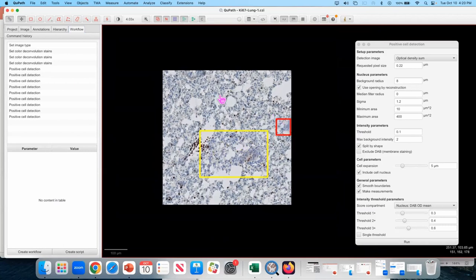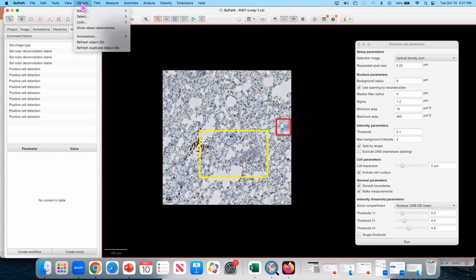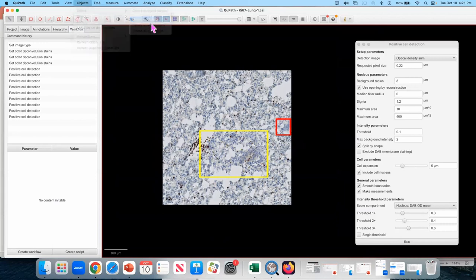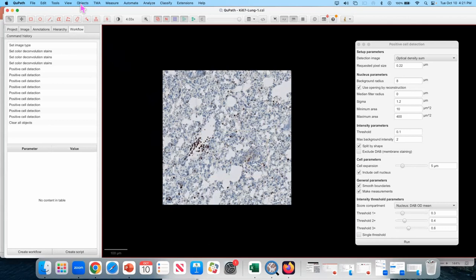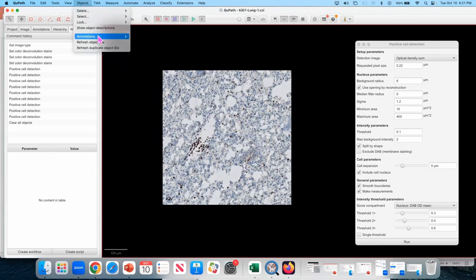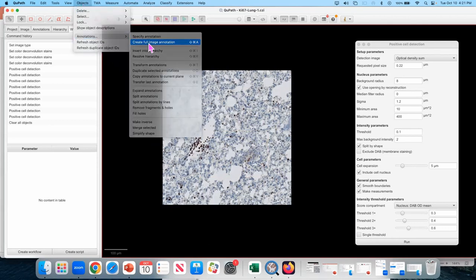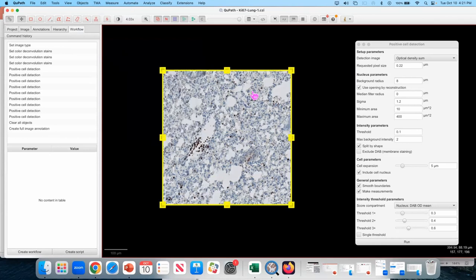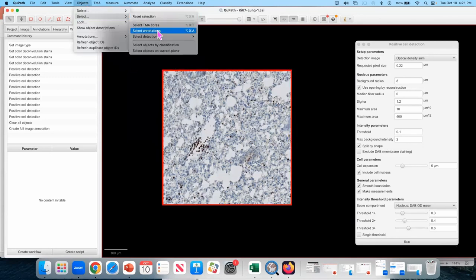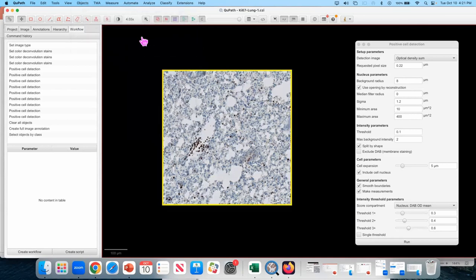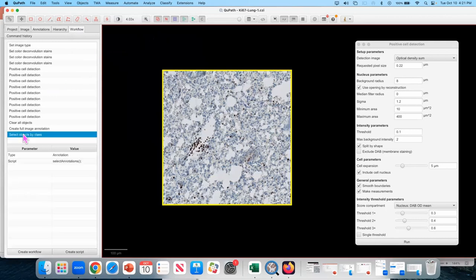Now, I want to try it on the whole image, because perhaps those are not very representative regions. So I'm going to go to objects, delete all objects. Yes, delete everything. I want to create a full image annotation, because for cell detection command to work, we need an annotation. I'm going to do a trick. I'm going to go to objects, select annotations. I had it selected. Why did I do that? The only reason for that was that I wanted to have this command to appear in my workflow.